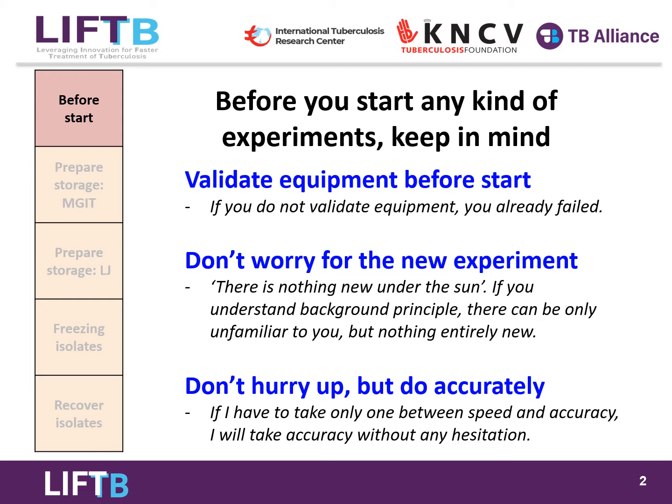Before we start the experiment, I would like to remind you of a few important things. First, equipment validation is the most important step before starting an experiment. Please ensure that your equipment is validated within the period stated in the management plan. If the validation expiration date is close and the patient enrollment period is not fully covered by the current validation certificate, I strongly recommend that you validate the equipment before starting the experiments.